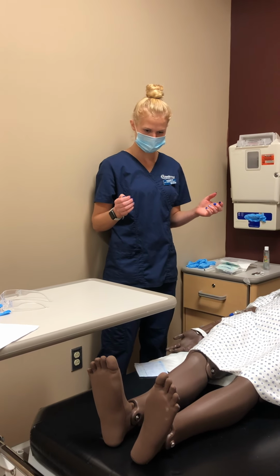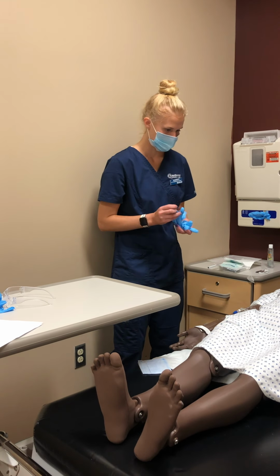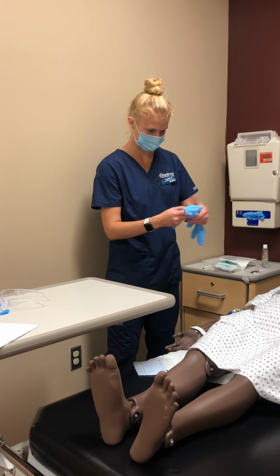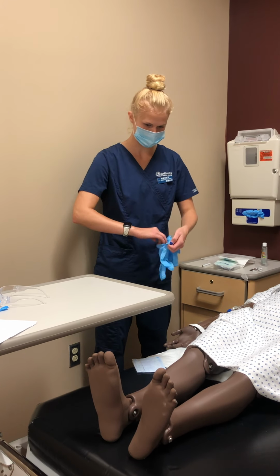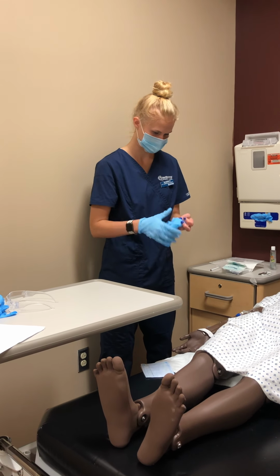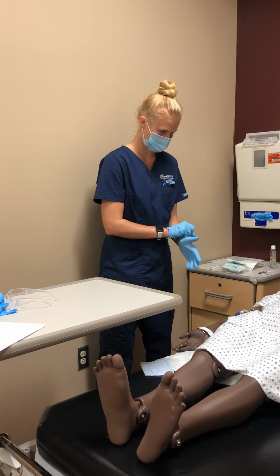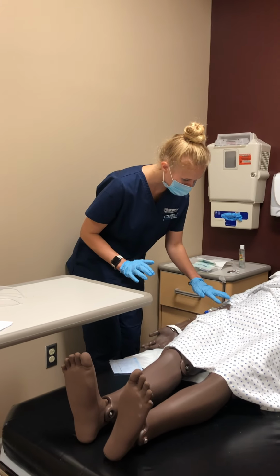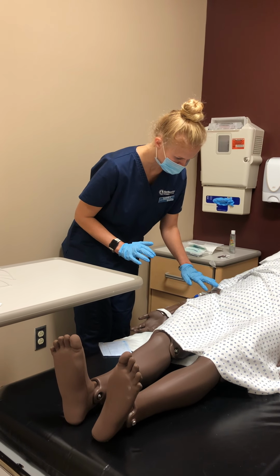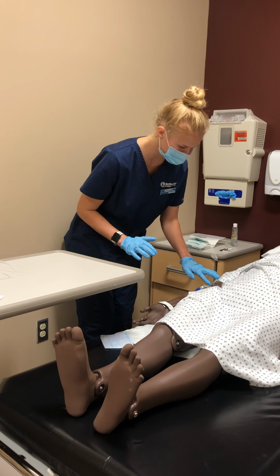Next, I'm going to wash my hands, and then assess my site, and don my gloves. I'm going to check for any infiltration, any redness, any dislodgement, any extravasation.